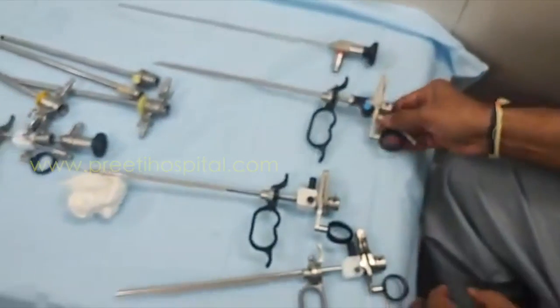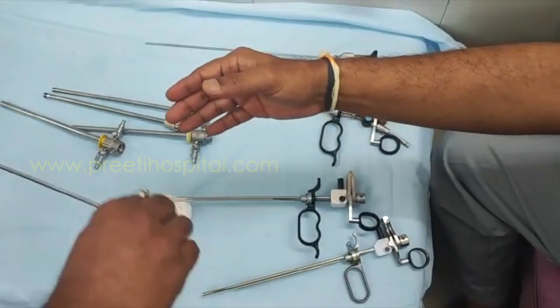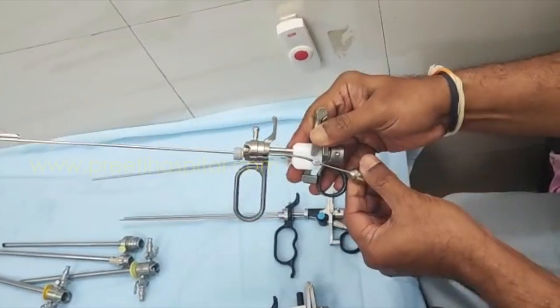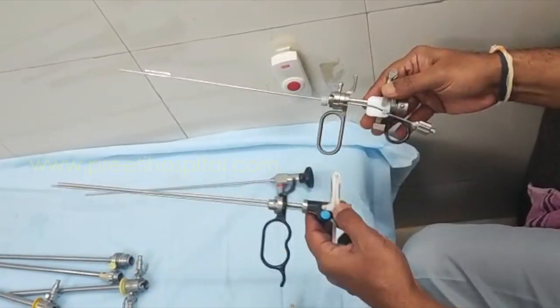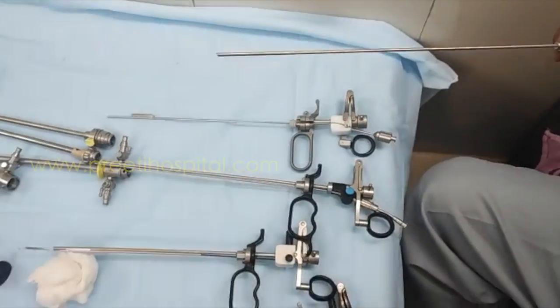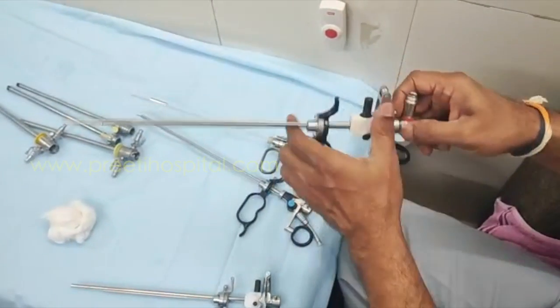Whereas in the Storz working element, it is simpler. This is the Storz working element with the laser attachment. The rotation is here — you tighten here. They have kept the rotation here for tightening, and this telescope will go through this entire unit.